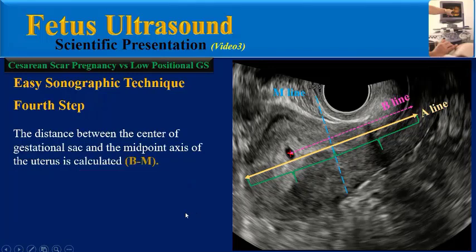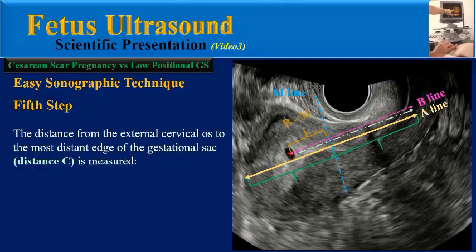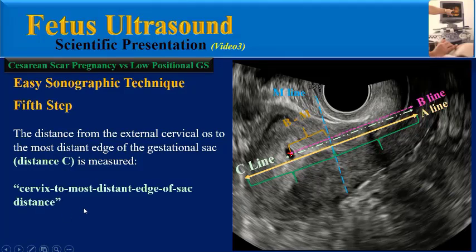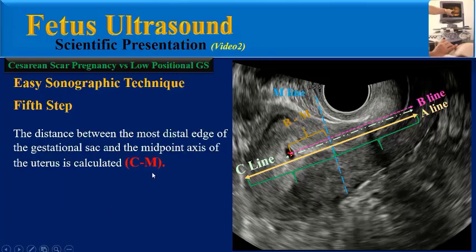The distance between the center of the gestational sac and the midpoint axis of the uterus is also calculated. In the fifth step, the distance from the external cervical os to the most distant edge of the gestational sac is measured — distance C, or C line — which is named the cervix to most distant edge of sac distance. The distance between the most distal edge of the gestational sac and the midpoint of the uterus is calculated, named CM distance.